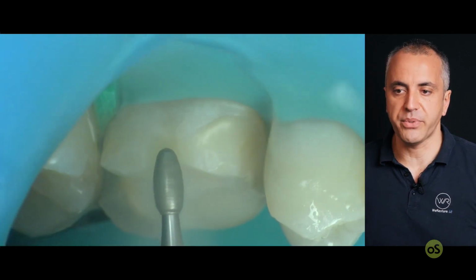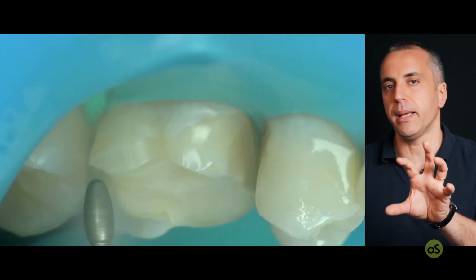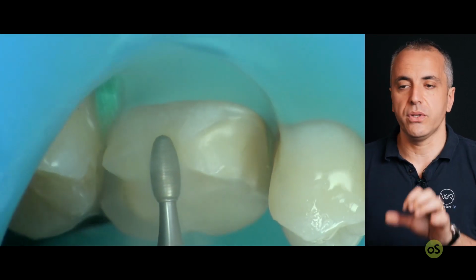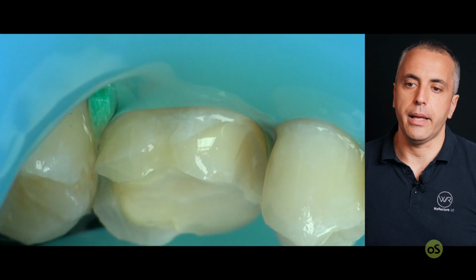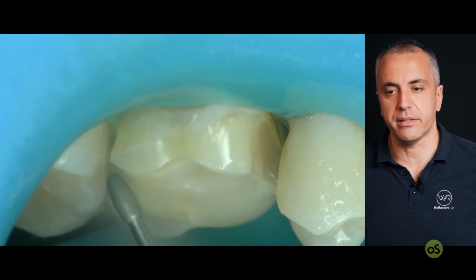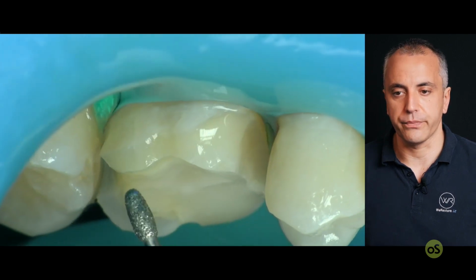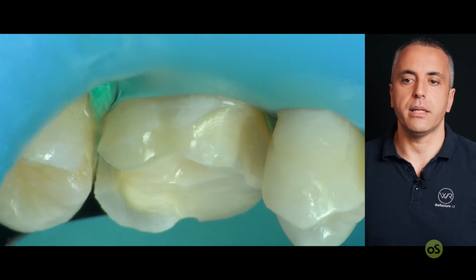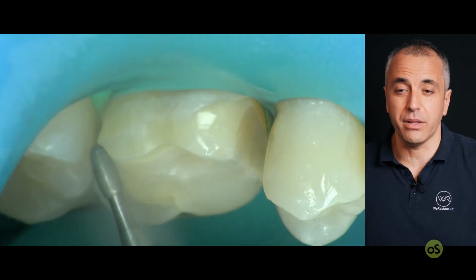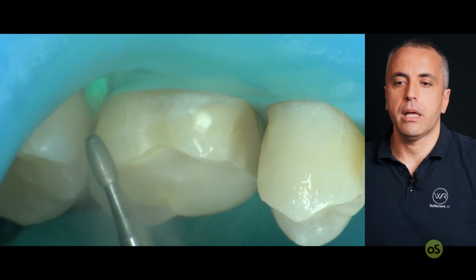This helps in positioning the overlay on the tooth. Of course, the most important part in positioning are the mesial and the distal boxes, but it also helps in mimicking the passage, the aesthetic boundaries between the tooth and the restoration. So this is the connection between the buccal and the distal, in this case made with this little burr. If we don't have space, we can use a flame.